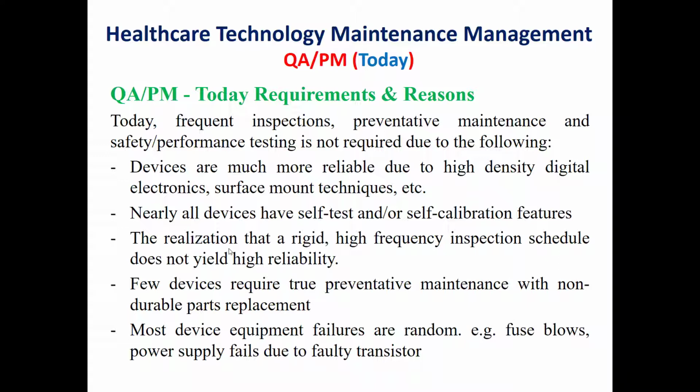Also, there is the realization that a rigid high-frequency inspection schedule does not yield a high reliability. Few devices require true preventive maintenance with non-durable parts replacement. Most equipment failures are random.